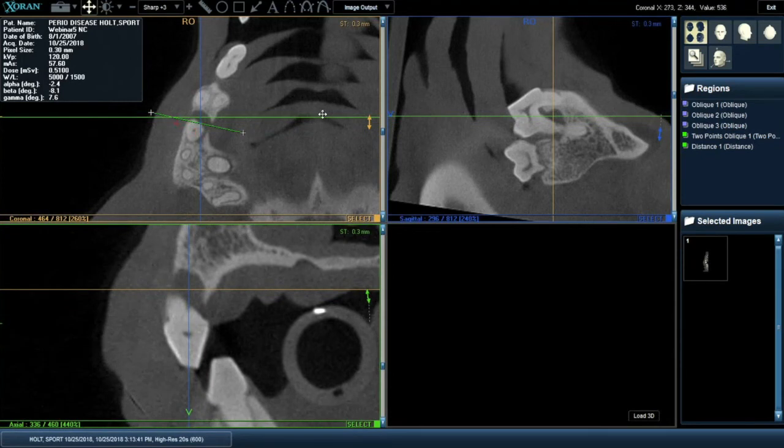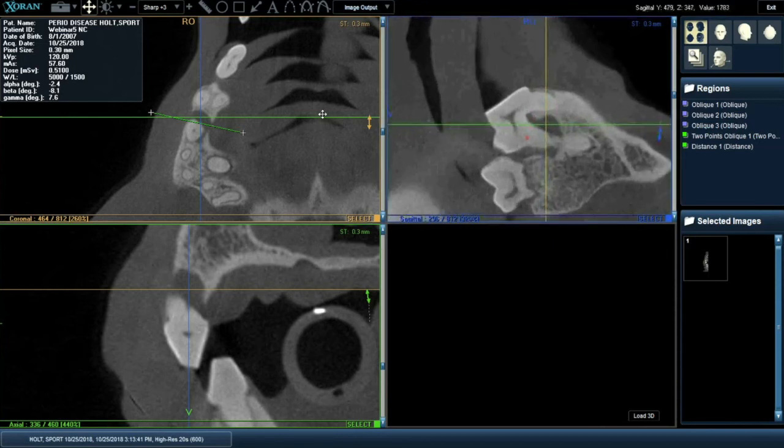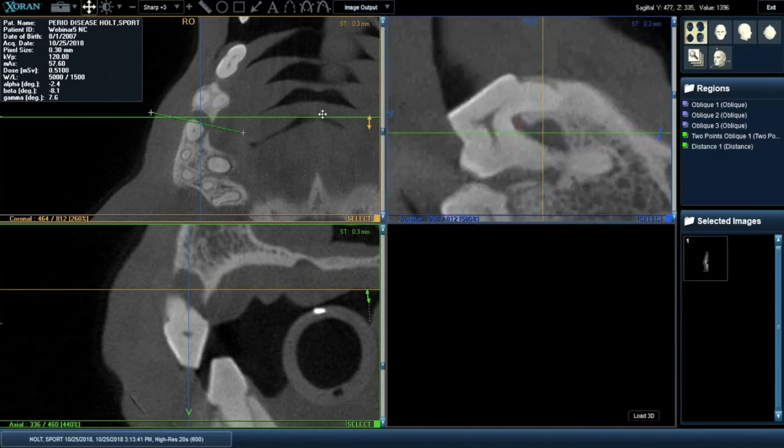It's an interesting question because very often when we have a defect, even like this one, the probe would actually end short of going through. There is a bone peak. There's a bit of bone in the furcation area, at least in part. The probe itself has a thickness to it, about 0.8 millimeter. So often you may or may not expect your probe to go right through this furcation.